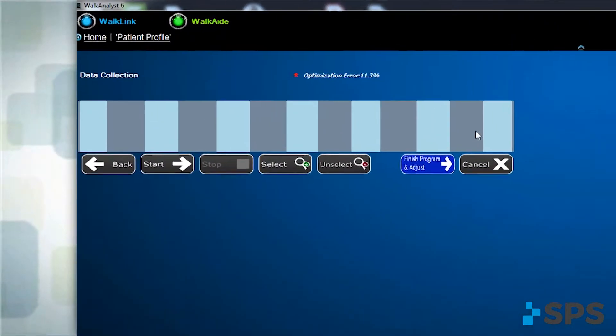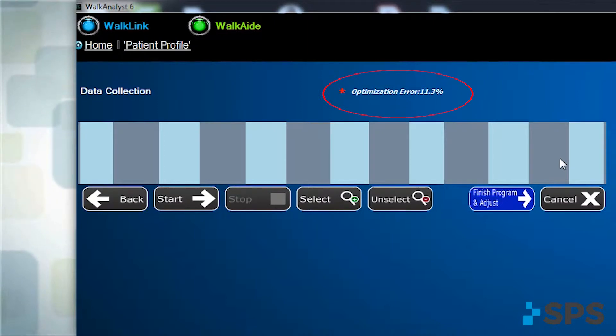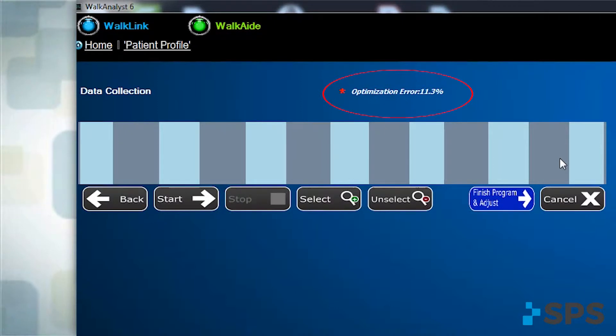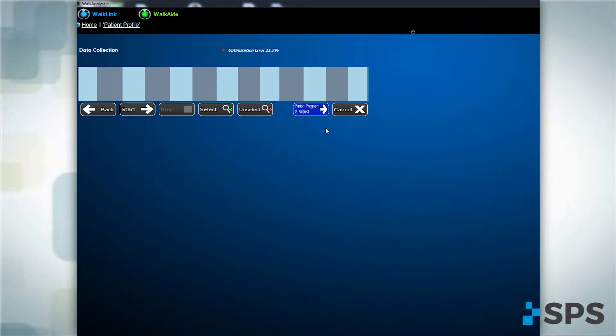If the optimization error is greater than 20%, click unselect and select a different series of bars. If the optimization error is still greater than 20%, click back and collect new data. If the optimization error is less than 20%, click next to send the program to the WalkAid.